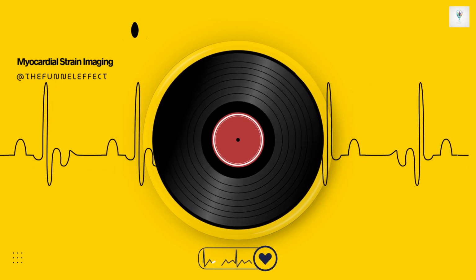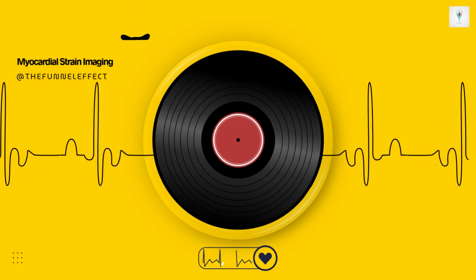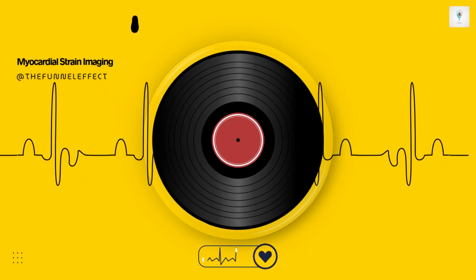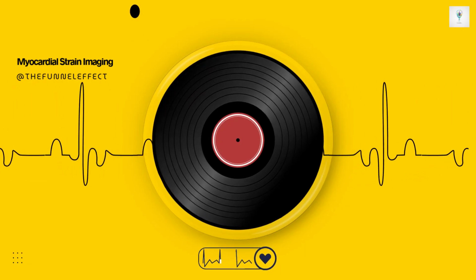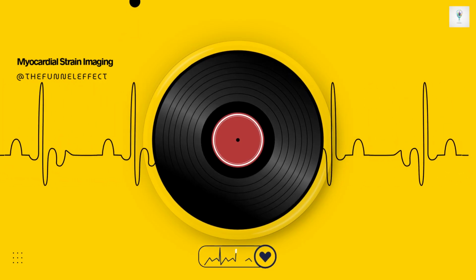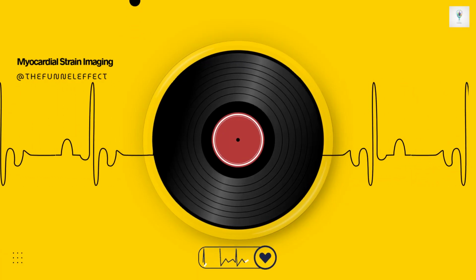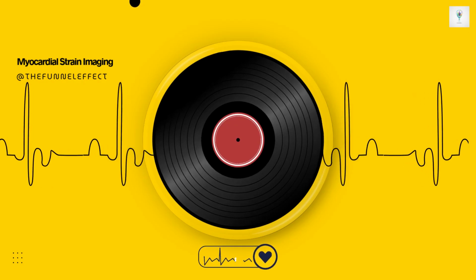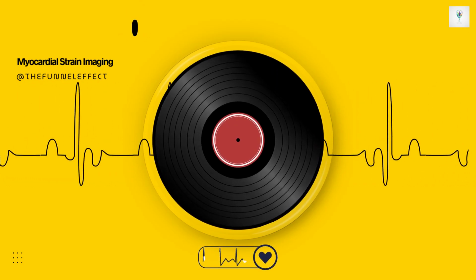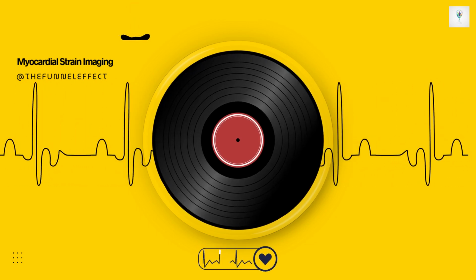And this lets us talk about efficiency. How do we separate useful work from wasted effort? We can break down the total work. Constructive work is defined as the work done by a heart segment while it is actively shortening during systole, essentially the energy that contributes effectively to ejecting blood. Okay, that's the good work. Right. Then there's wasted work. This represents energy that's lost or doesn't contribute to ejection. It's calculated as the work performed on a segment that is paradoxically lengthening during systole, or work done after the aortic valve closes.